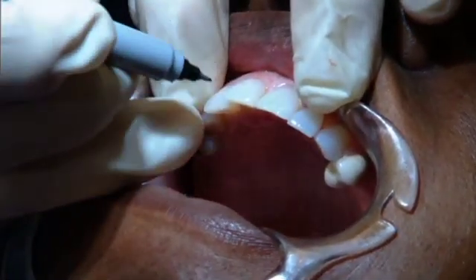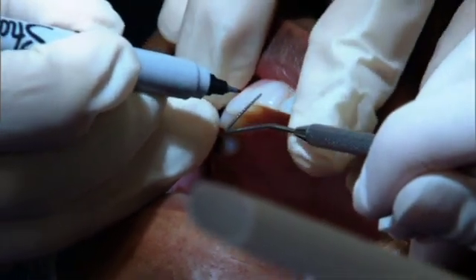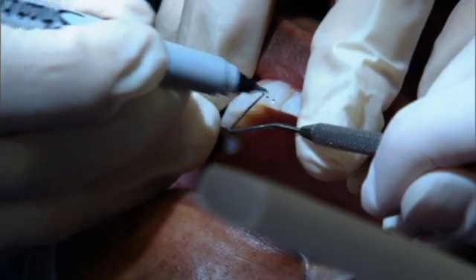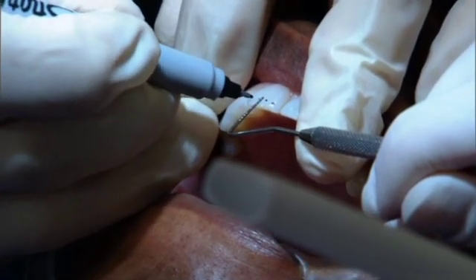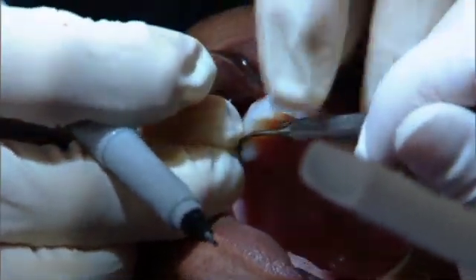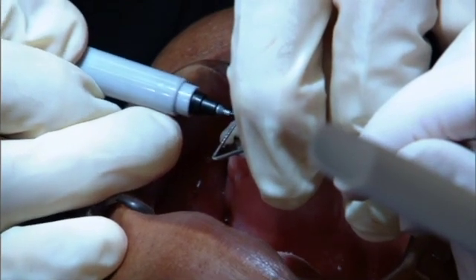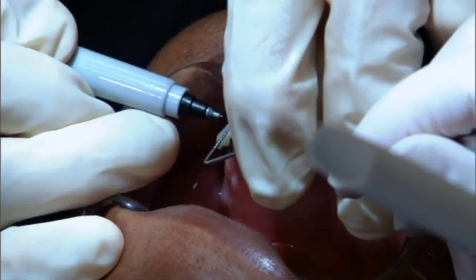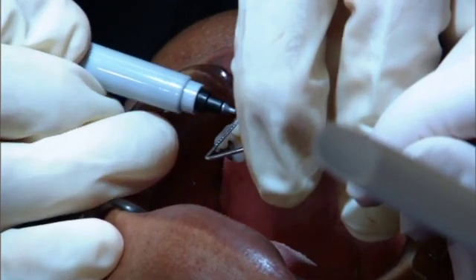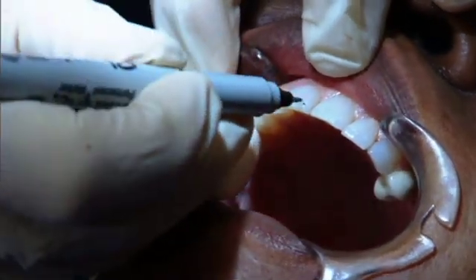Kathy, if you'll put that perio probe up. One of the things I like to do is use a perio probe and make some measurements. Go ahead and measure 2 millimeters to determine where we want to go to get our incisal reduction done. This is fairly simple to do, and if you use a Sharpie marker, it will stay on the tooth.